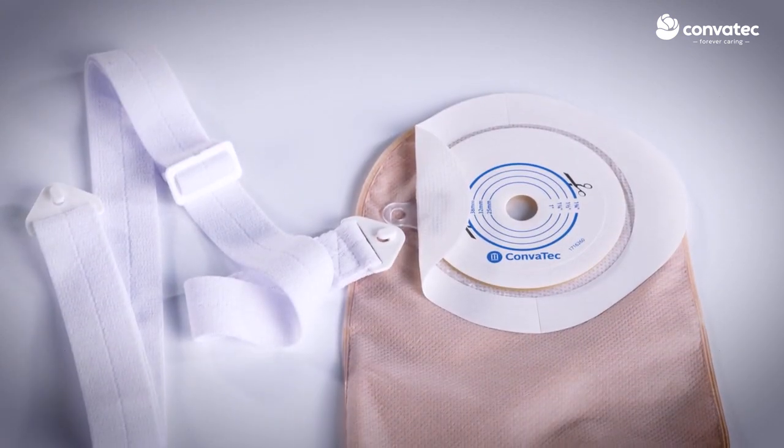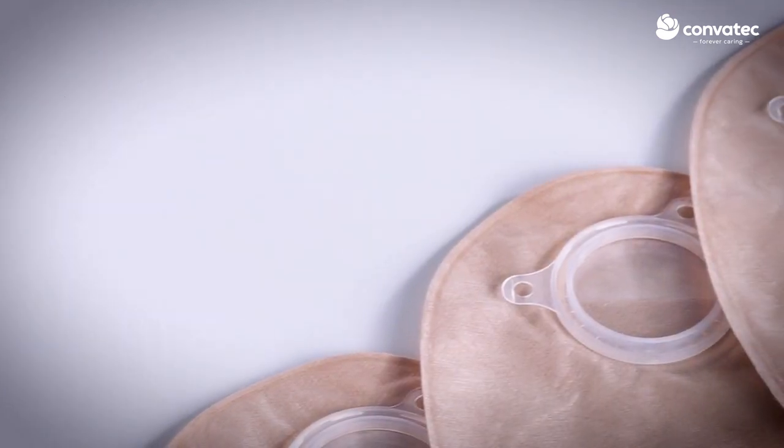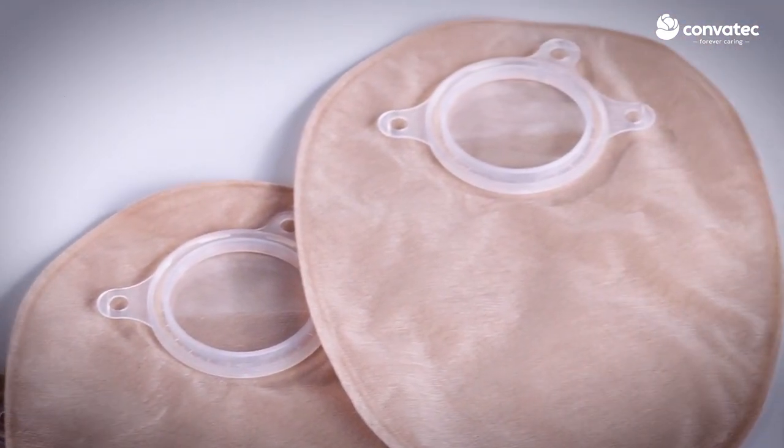On a one-piece system, belt tabs are between the pouch and base plate. On a two-piece system, belt tabs are on the pouch flange.